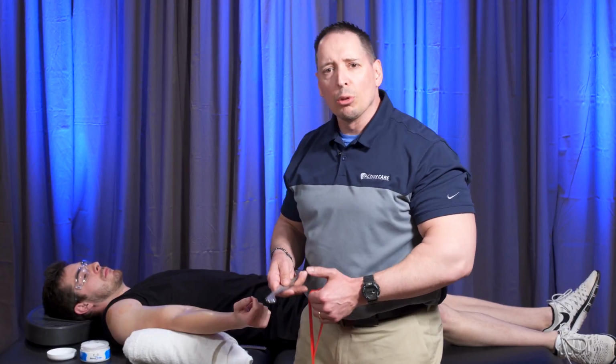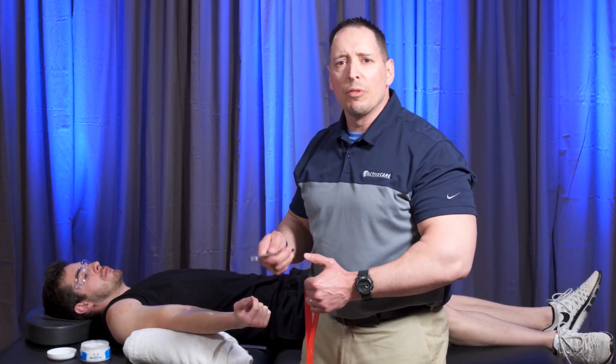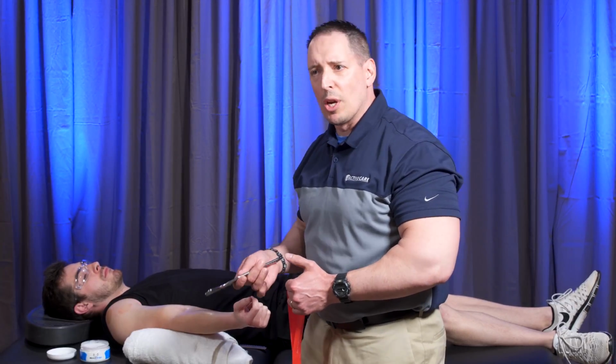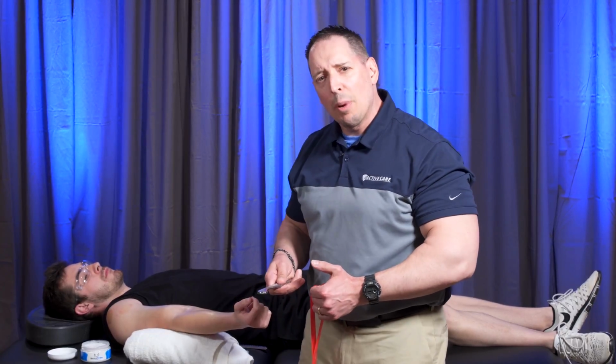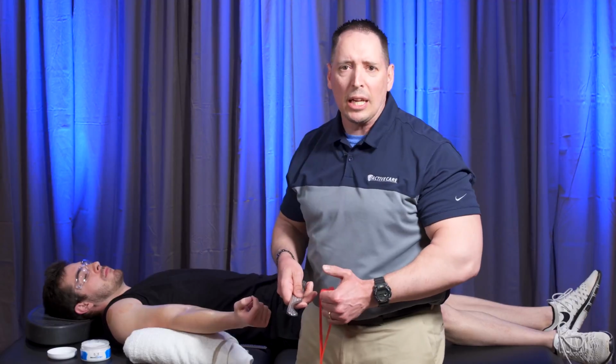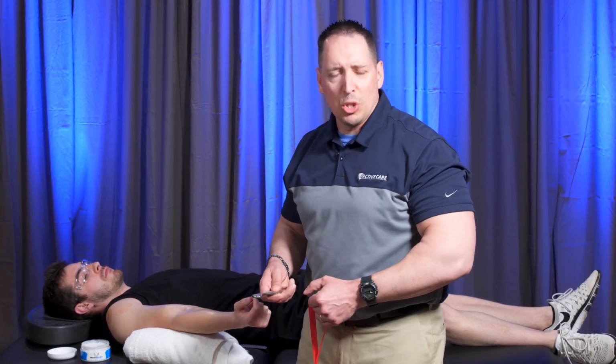So what we're going to apply is a low load stretch over a period of time, along with an instrument-assisted soft tissue mobilization technique. So again, evaluation is critical for the patient. We want to make sure that we know what we're treating. So this works best, again, with those extrinsic soft tissue restrictions.